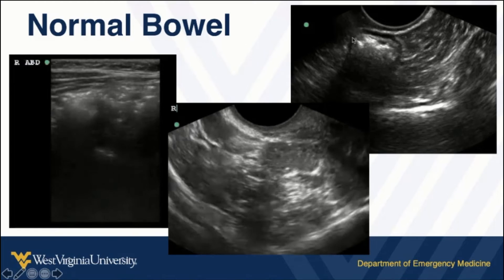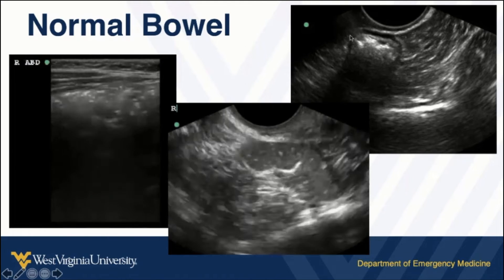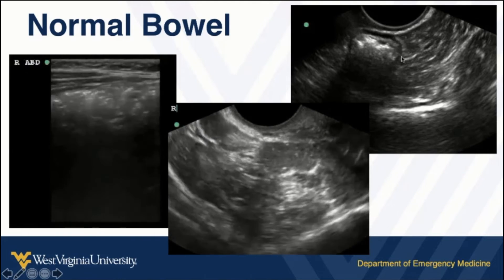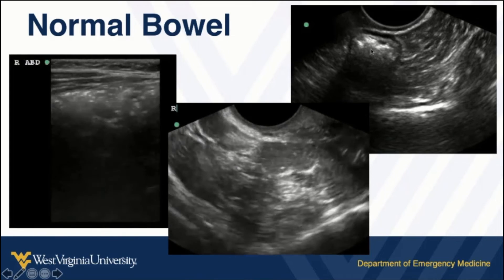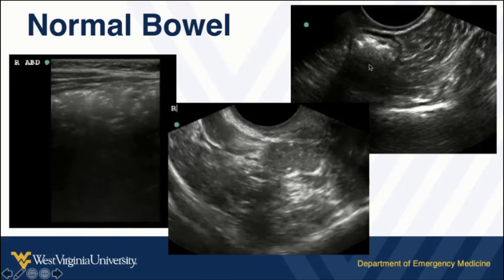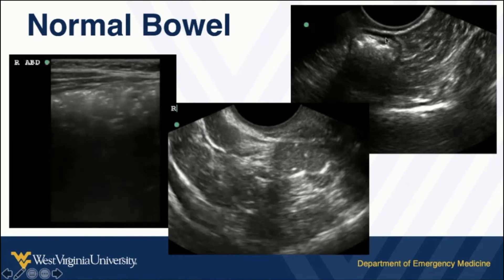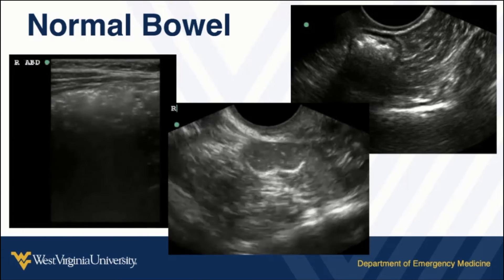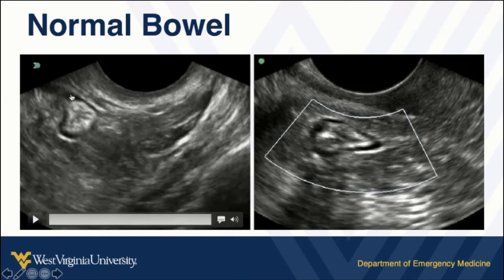Sometimes we can see the multi-layered image of what the bowel looks like. One of the hallmarks of that is this black outline — that's just one of the wall layers — and then externally here is a white outlining black of the adventitia. Inside we see a little bit of air and some of the interstitium of the bowel, as well as some artifact coming down from the bowel itself. When you see this black outline all around, outlined by another layer of adventitia, that is almost always bowel — don't mistake that for a gallbladder filled with stones or an ovary or some other anatomical structure.